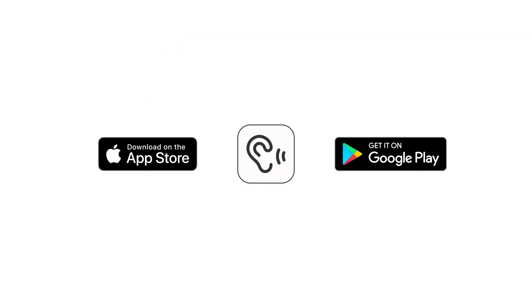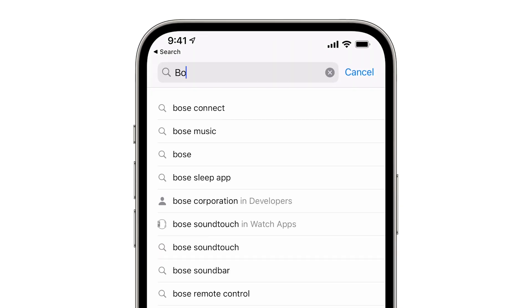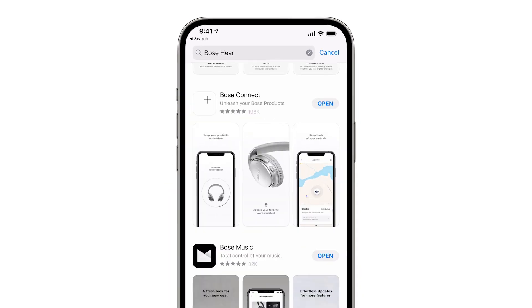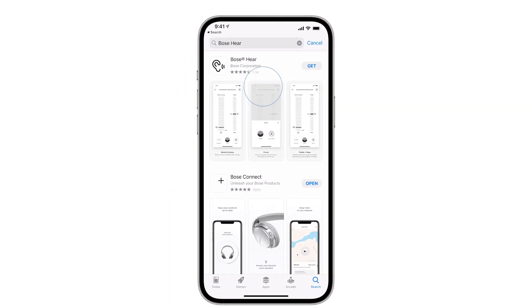To do so, you'll need to download the free Bose Hear app via the Apple App Store or the Google Play Store. In the store, search for Bose Hear. There are many apps from Bose, so be sure to install the app named Bose Hear.